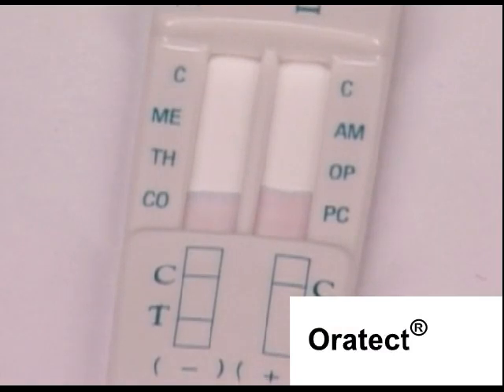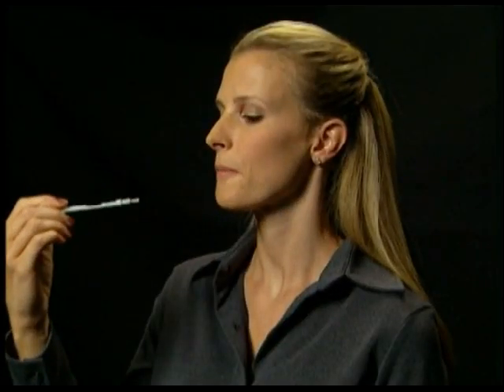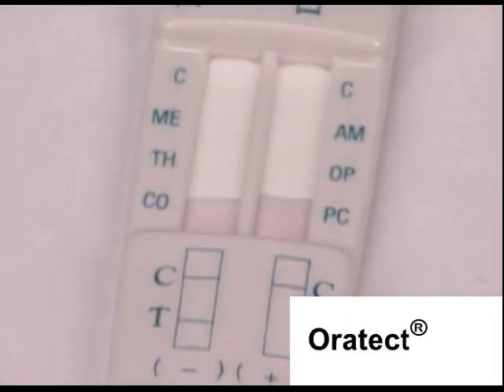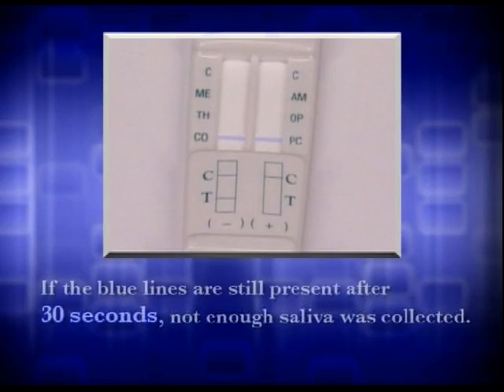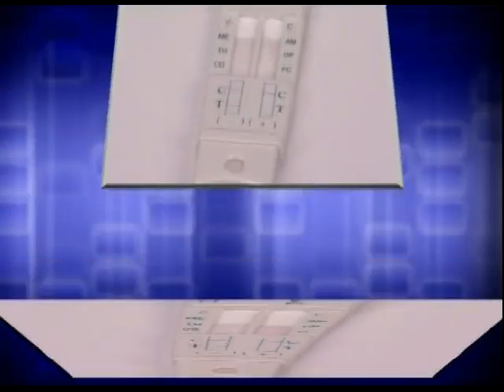The flow of the blue lines at the test windows indicates that a sufficient amount of saliva has been collected to activate the testing. Have the donor remove the device from their mouth as soon as the blue lines start moving. If the blue lines are still present after placing the collection pad under the tongue for 30 seconds, this means that not enough saliva has been collected. Therefore, instruct the donor to repeat the process until the blue lines flow.